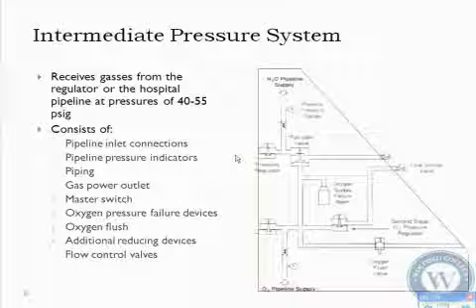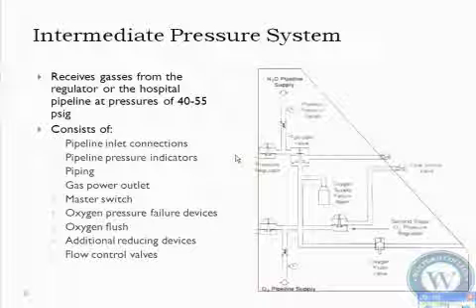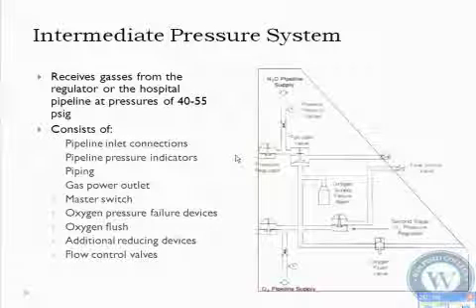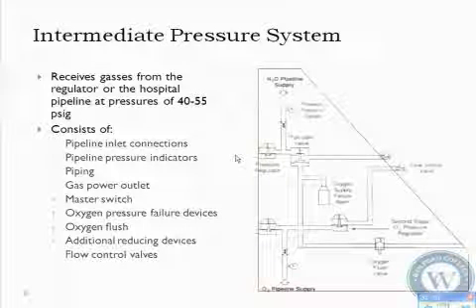All right, so here are all the components of the high pressure system, of the intermediate pressure system. With the pipeline pressure coming in here, your gauge is going to read 50. It can come through a tube through your O2 flush valve that completely bypasses the entire machine. This is simply a tube that comes from the wall and runs around the front of the machine. Remember seeing that little green O2 flush valve? It runs directly in front of that flush valve and goes directly to the patient. So it never goes to the vaporizer or your flow meters. Therefore, you can deliver 50 psi or so to a patient if you're holding that down.